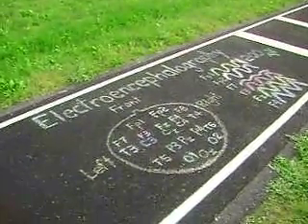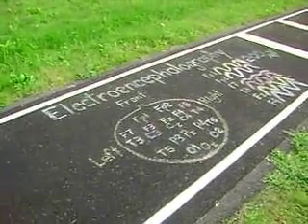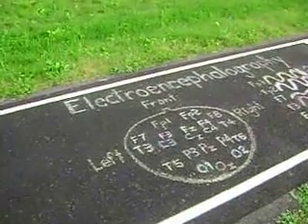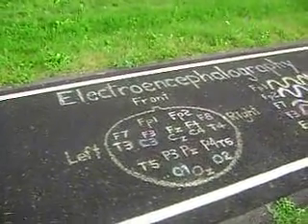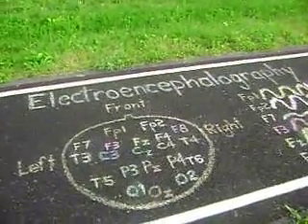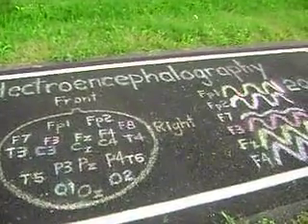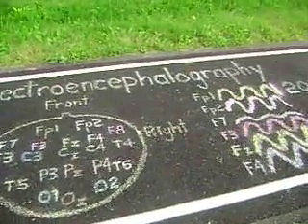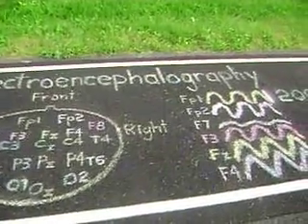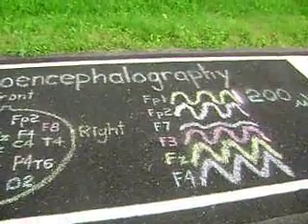Electroencephalography. EEG abnormalities include the following. Epilepsy: interictal epileptiform activity consisting of spikes, sharp waves, or spike wave complexes is strongly but not absolutely correlated with epilepsy. Thus, the presence of spikes, sharp waves, or spike wave complexes does not unequivocally indicate a diagnosis of epilepsy, nor does their absence exclude it.